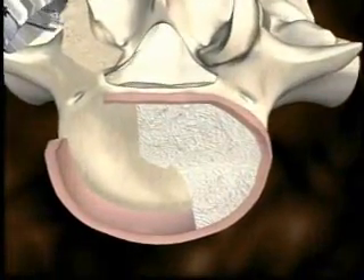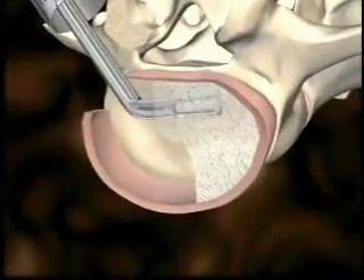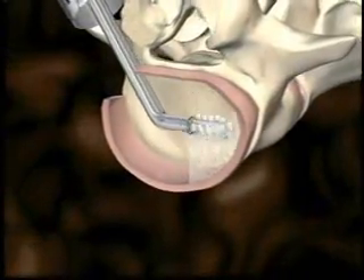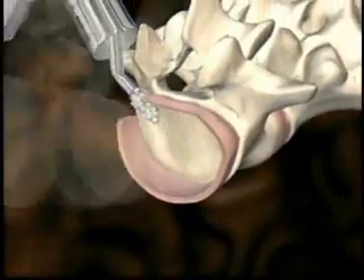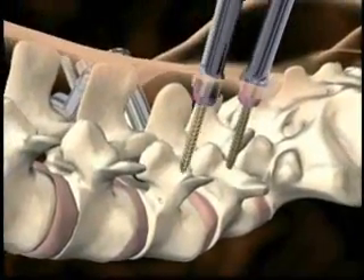Rotating shavers are used to remove the remaining disc material. Once the discectomy is complete, contralateral instrumentation is inserted using the CD Horizon Sextant Rod Insertion System.